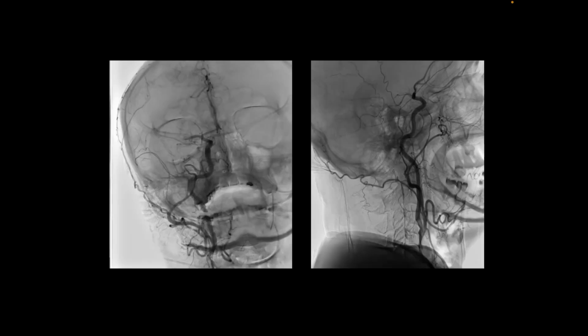Clear? Yes. Okay. Now we'll come to the next part. This was the first shoot, sir. So this is not a DSA. So you can see the skull bone. Yes. In the new machines, it's very easy. You just have to press the DSA switch and you can convert it. If you want to see the bony landmarks, you can view this. If you want to cut off the bony landmarks, just view the DSA picture.